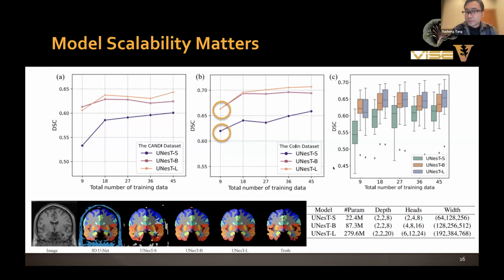But I think this model can be used as a foundation model, which can be used as a pre-trained model, and you can fine-tune it on your tumor dataset. I think it can turn out to be a very good performance regarding the BraTS data.